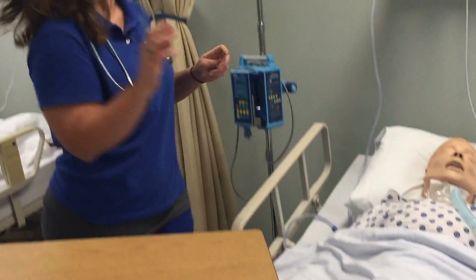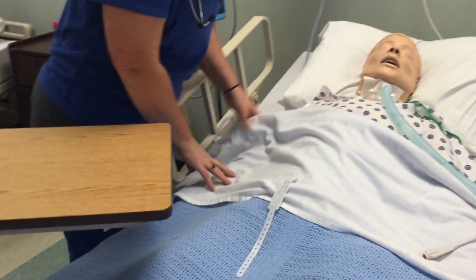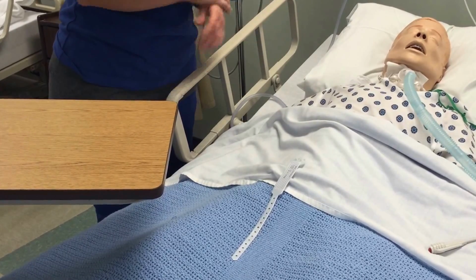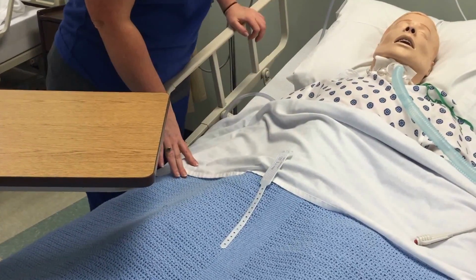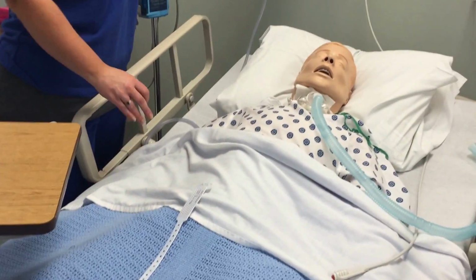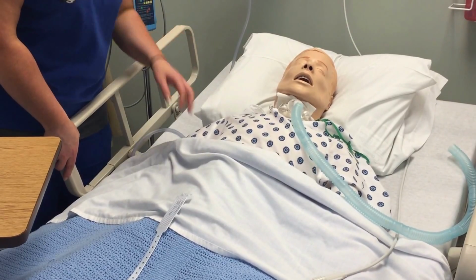Provide for privacy. Okay. Just want to verify your name and birthday. It's Barbara Dan. Okay. Date of birth is 8160. Good. Do you have any allergies to anything? Latex? Anything like that? No? Okay. Great. All right. I'm just going to facilitate for positioning, like for breathing.